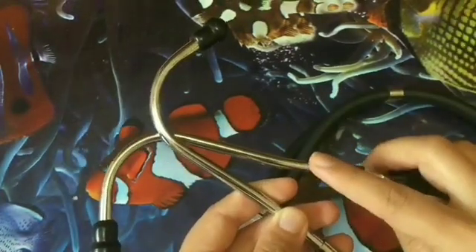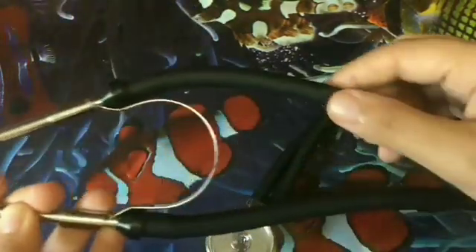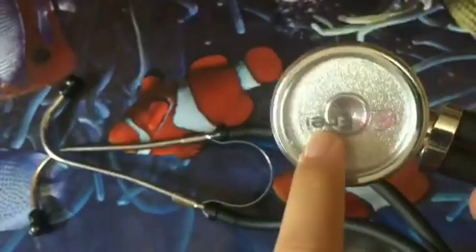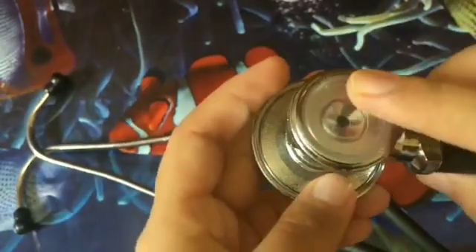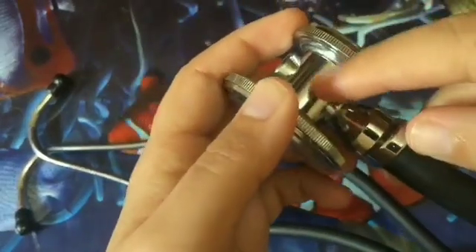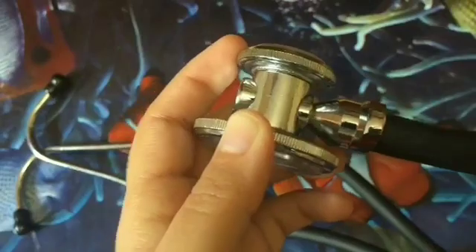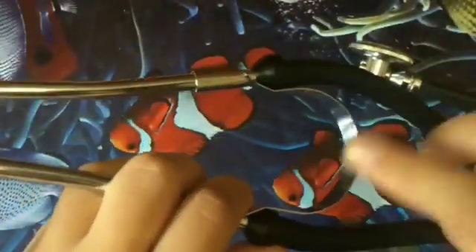This part is the ear tube. This tube is known as the tubing. This is the diaphragm, used for high frequency sounds. This part is the bell, used for low frequency sounds. And this portion is known as the stem. This thing is the binaural spring.